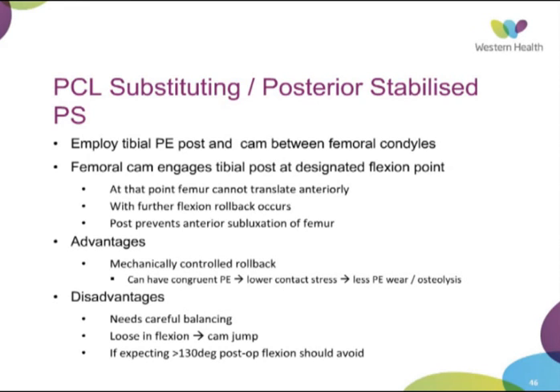The advantages of this technique are that having a mechanically controlled rollback by the prosthesis can allow a more congruent tibial insert to decrease the contact stresses and lead to less polyethylene wear. But the disadvantages of it are that it probably needs more careful balancing to achieve that.